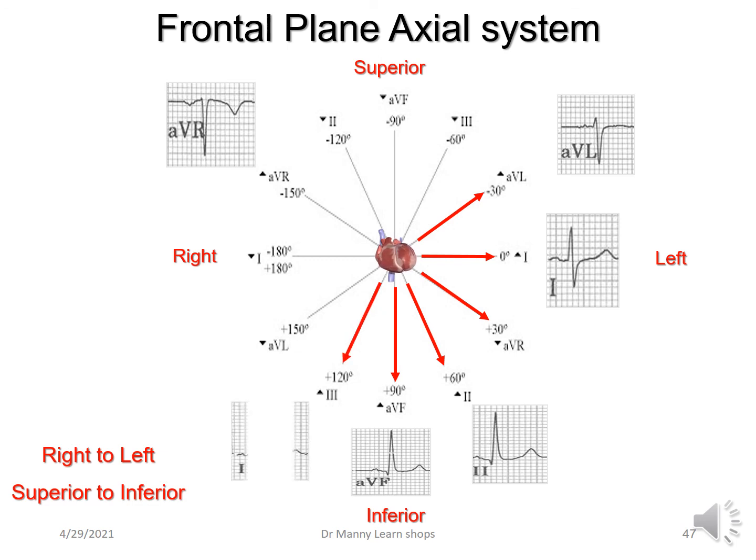Then you've got lead 3, which is positive, but typically it isn't as positive as lead 2. They almost look identical. Lead 3 will be more negative, but again, it can vary. Everybody is different. These are your 6 leads in the hexaxial system, and they all have figures associated with them.